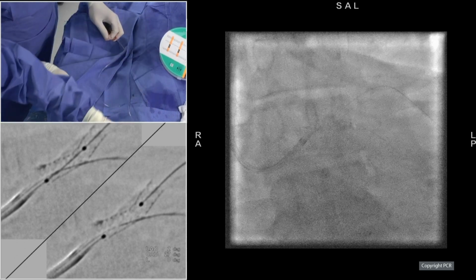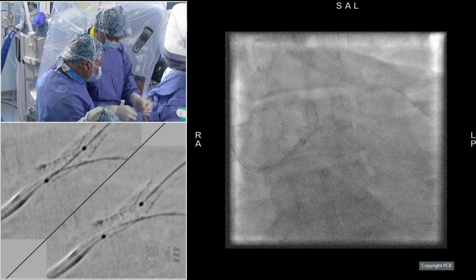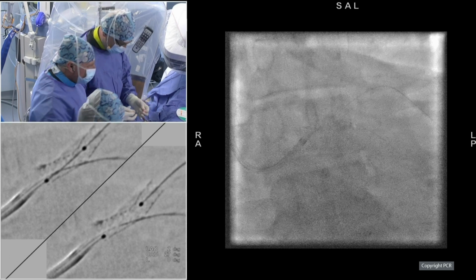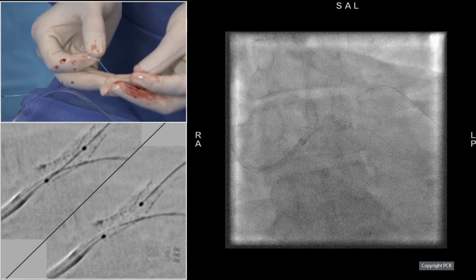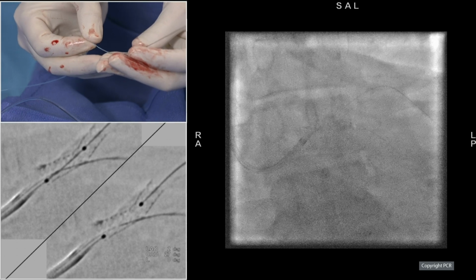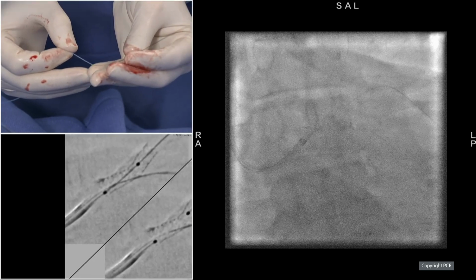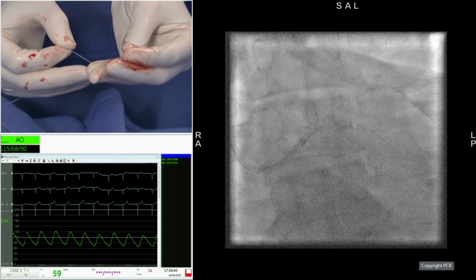It's always when you try to change the wire, then it works. That's the kind of mysterious things in interventional cardiology. I'm going to change the wire, and at that time it's going to... Like the wire feels the pressure. Yeah, I always say to the nurses, please start to threaten me with something.